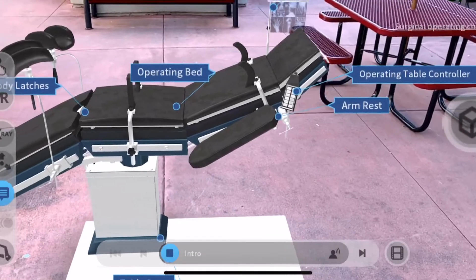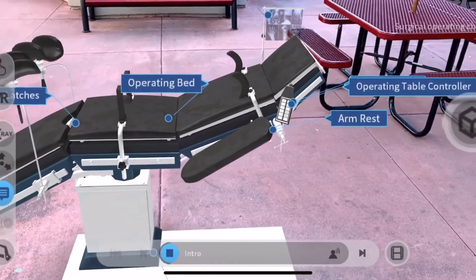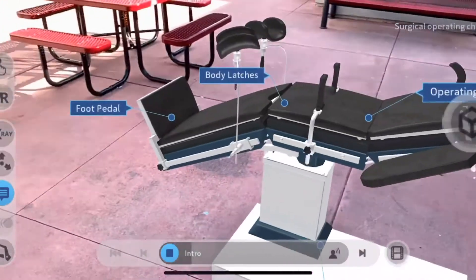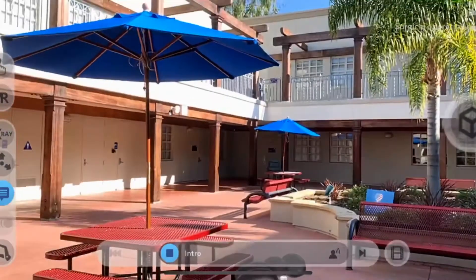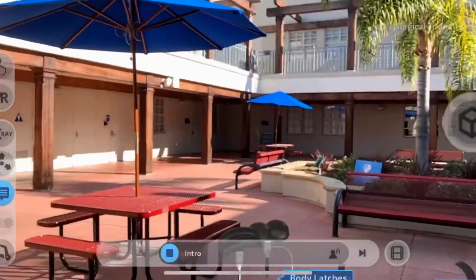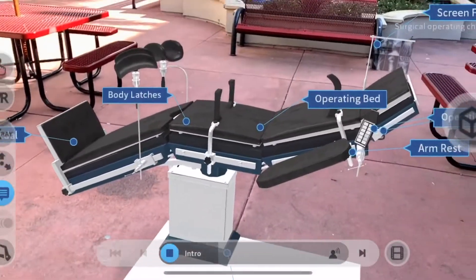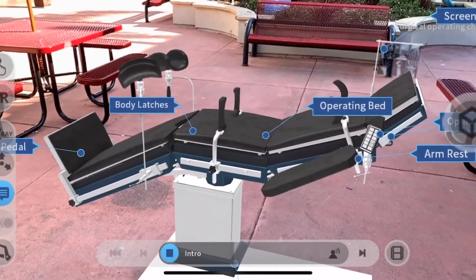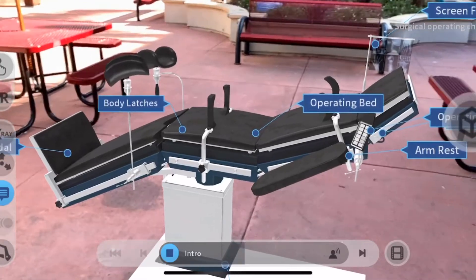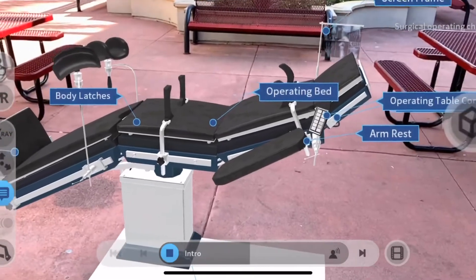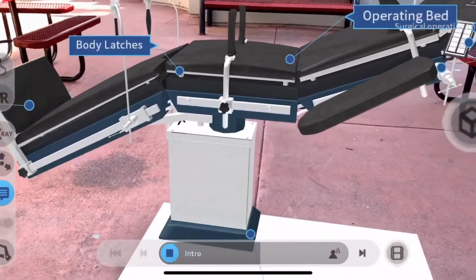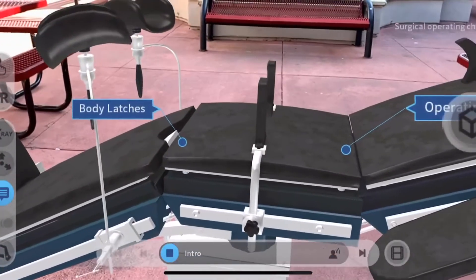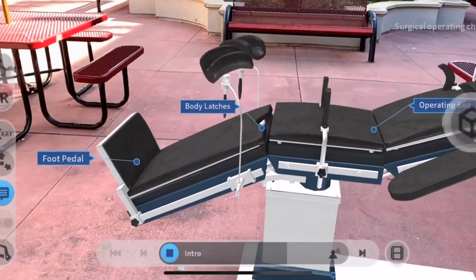Welcome to the lesson on how to operate a surgical operating table. This table has been designed for surgical operations and treatments. The patient lies on this table during surgical operation. The surgeon can optimally configure table settings to ensure safe positioning of the patients during all surgical procedures.